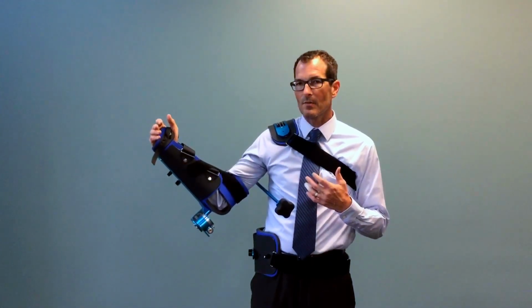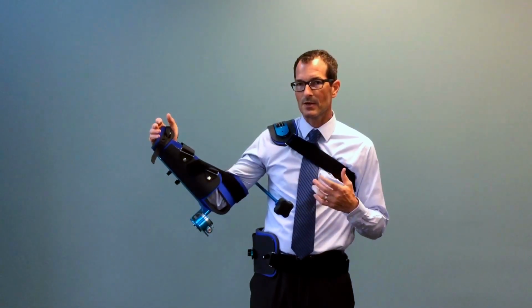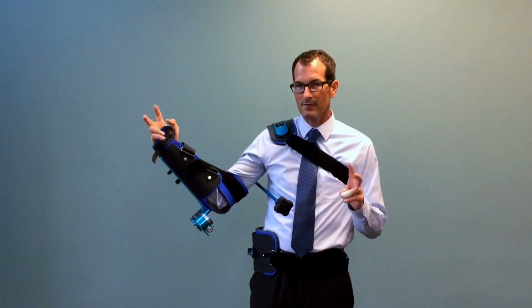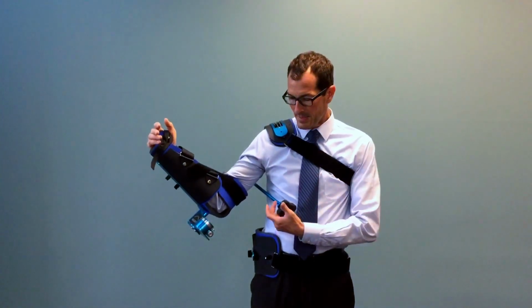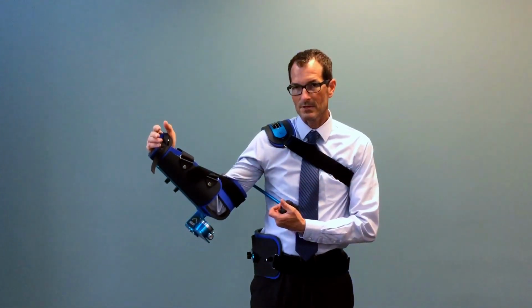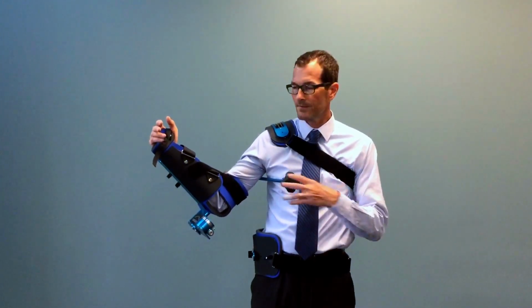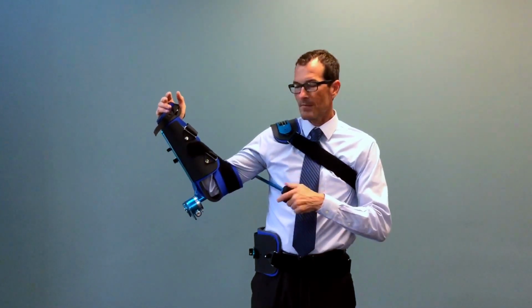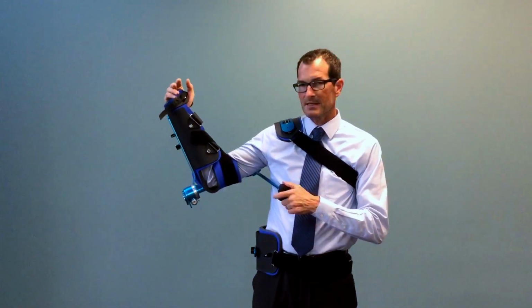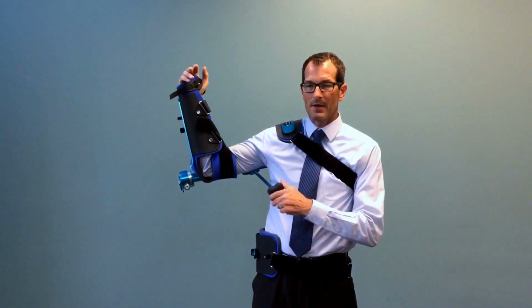If I want to move the arm into abduction, we simply instruct the patient to shift their spindle from elbow to armpit. So the patient simply grabs the spindle here, squeezes it, moves it towards their armpit. They'll hear a click, and now the hinge behind my shoulder, close to my scapula, is the hinge that's going to cause abduction.